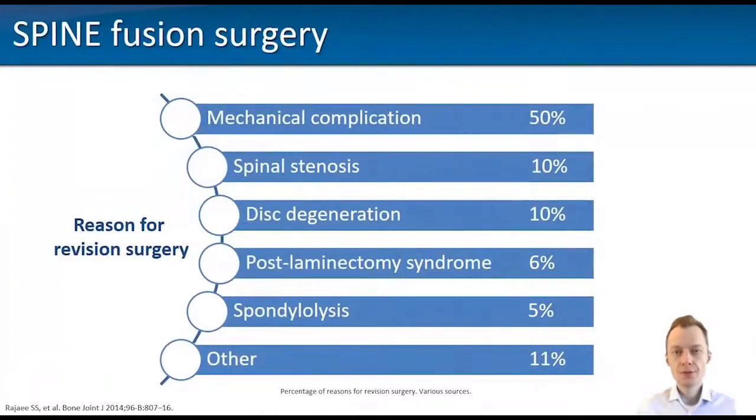So how can we use bone SPECT-CT in the post-operative spine after fusion surgery? First of all, we need to have an idea of the reasons for revision, so the complications after these procedures.